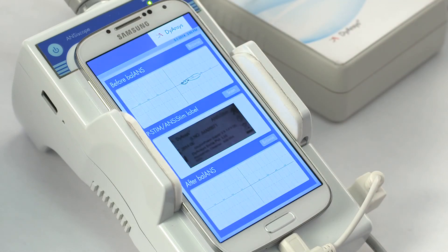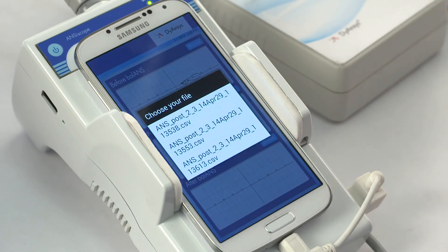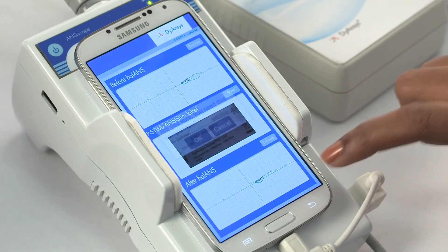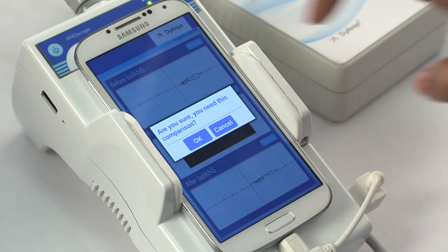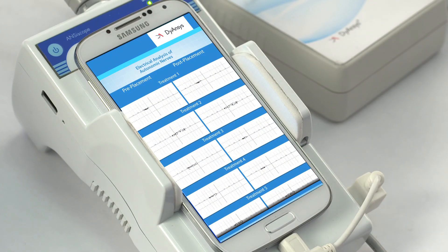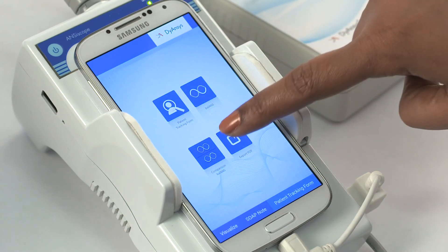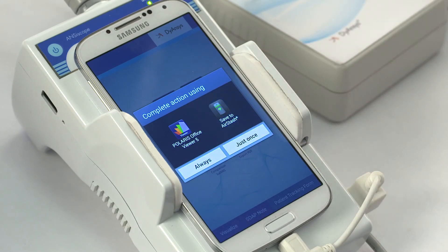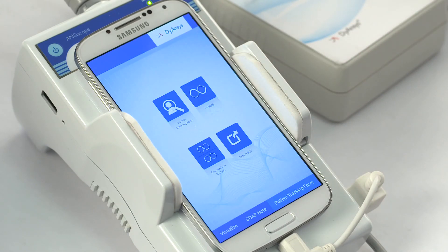View the balance trajectory by selecting a file in the balance trajectory after treatment. Go back. Press the comparison balance icon to view the comparison of the balance trajectory before and after each treatment. Go back. Press the Export PDF to transfer the entire patient tracking form to the Airstash external memory.